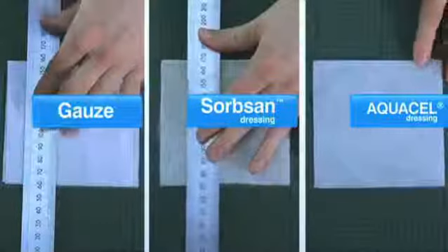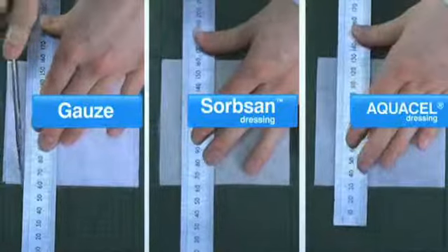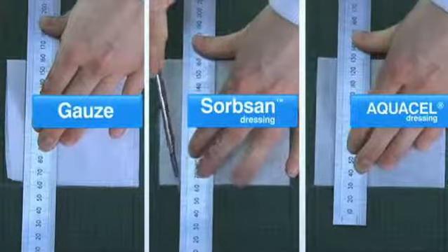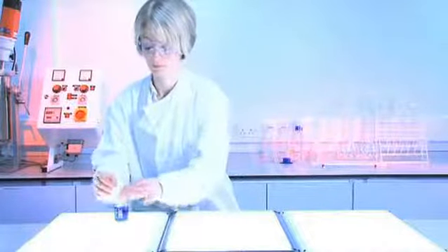We cut a 1.5 cm x 10 cm sample from each product in the machine direction. For the gauze, four layers are cut together to be comparable to Aquacel dressing and Sorbzan.